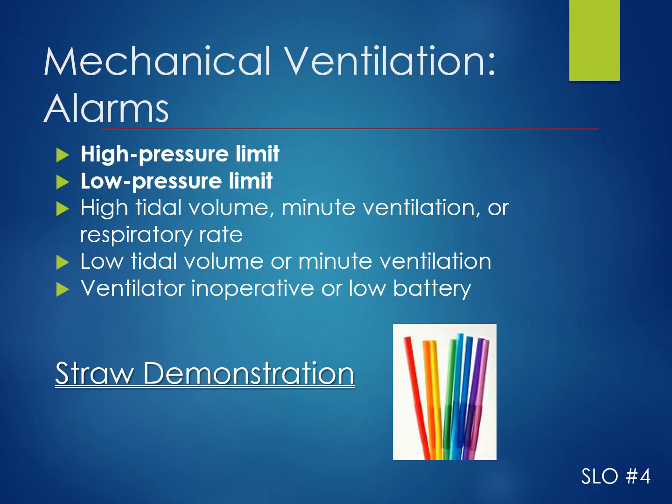Okay, so talking about our alarms, if you have a straw available, you can go ahead and participate in this. Otherwise, I'm just going to talk you through it. So picture you have a straw in your mouth and you're blowing out of the straw, but you're covering up half of the end of it. So there's a little bit of resistance that you're meeting, but you're still able to blow air through it. So that is normal. That's what a ventilator wants to sense.